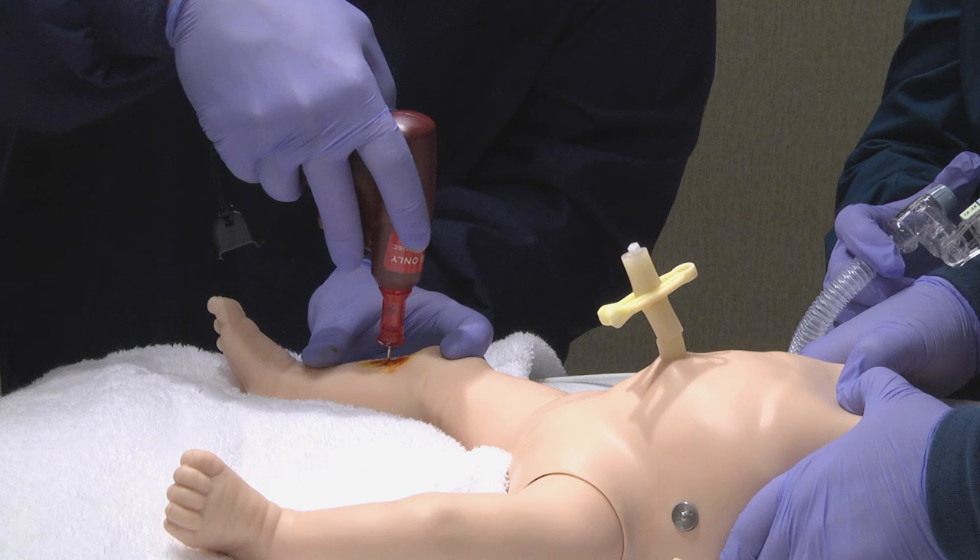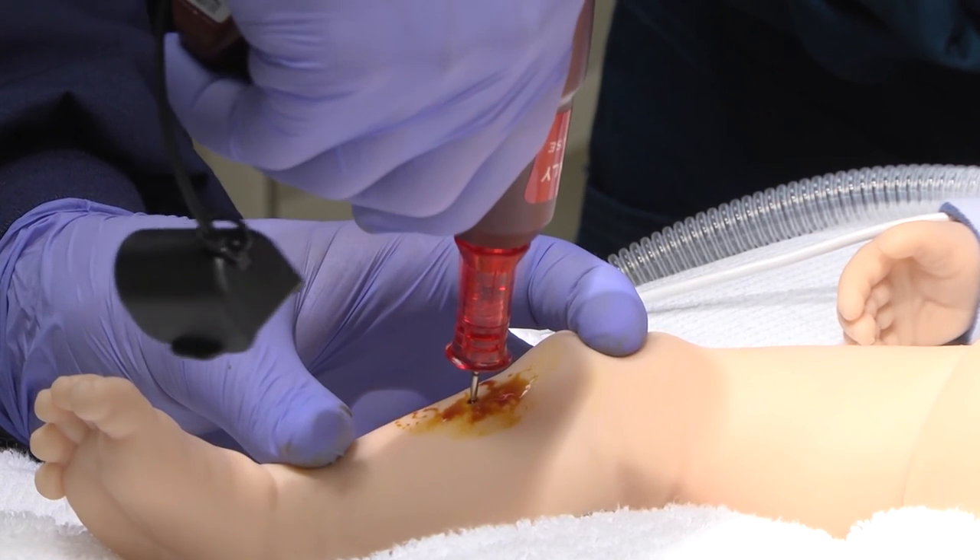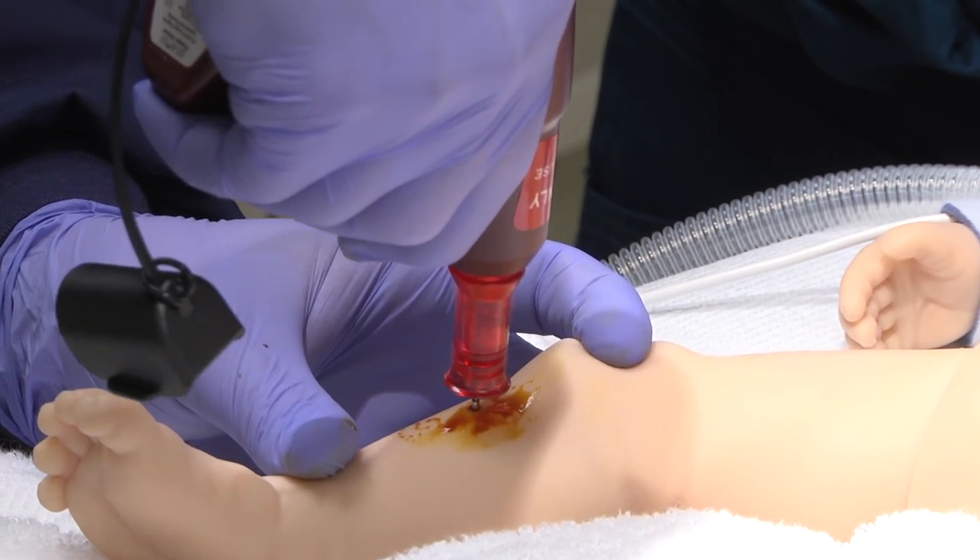Press the trigger while holding downward pressure as described in the manufacturer's instructions. When the needle enters the marrow space, a distinct pop is noticeable.